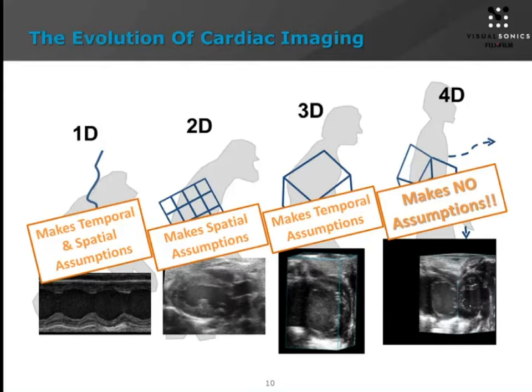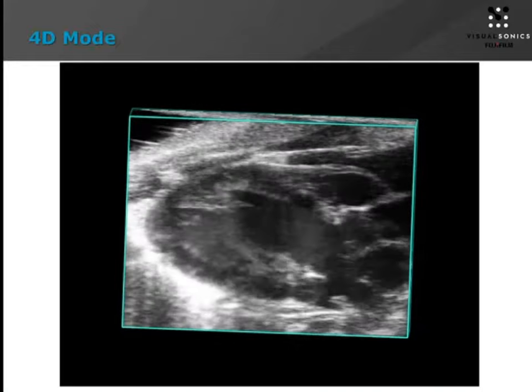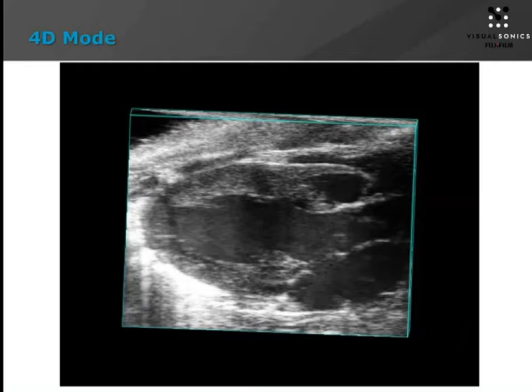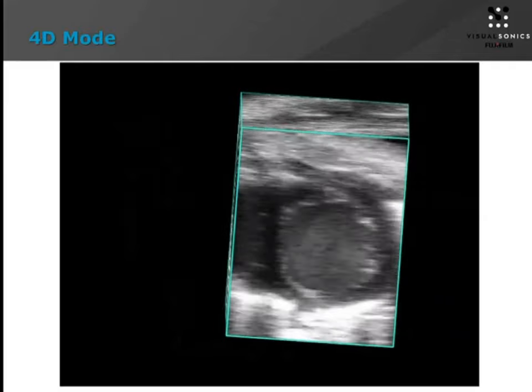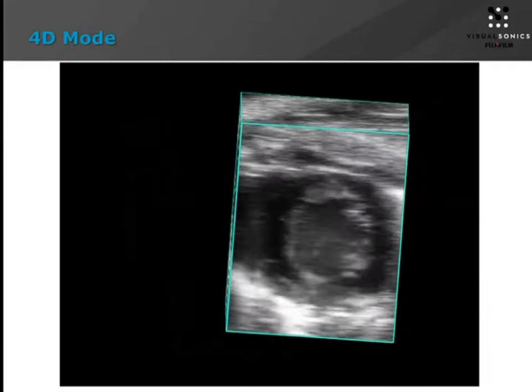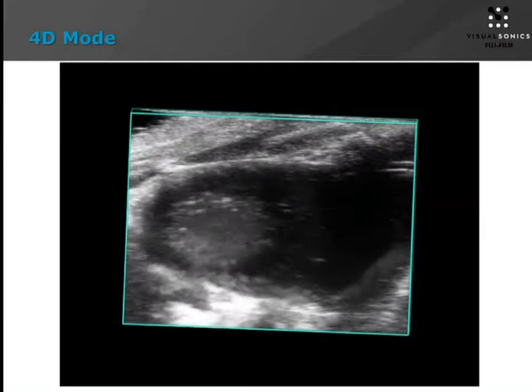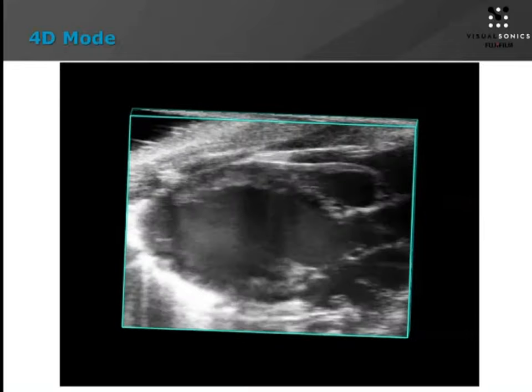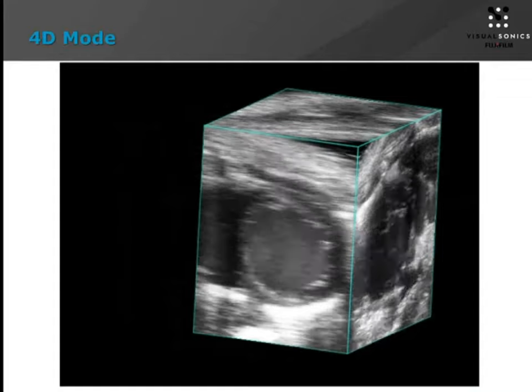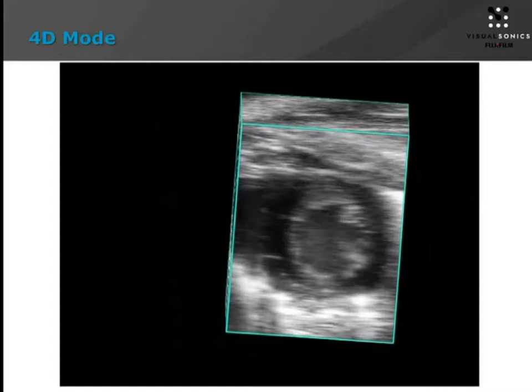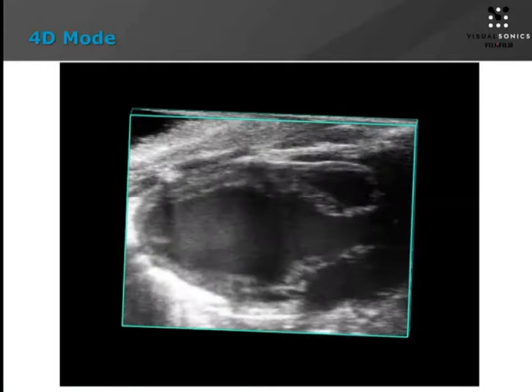Here's an example of what a typical 4D image looks like. This is a long axis view of a mouse's heart and you can see as we rotate and move around the cube, we get a fantastic view through short axis and long axis views, all the way from the base up through to the apex, giving a view of the dynamics of motion through a representative cycle in the heart. Going back to the assumptions discussed earlier, with this type of image there are now no assumptions. You have the entire chamber and the full time cycle of one cardiac cycle to look at for analysis.